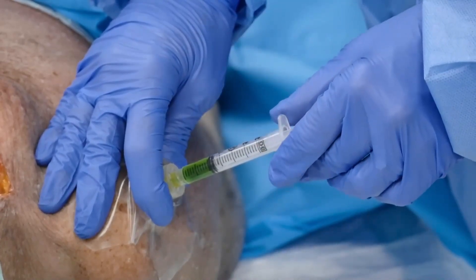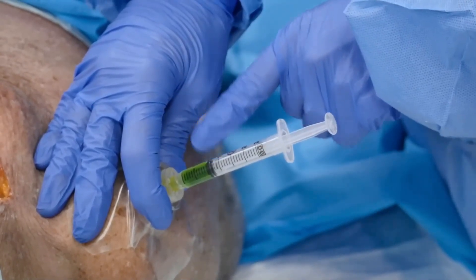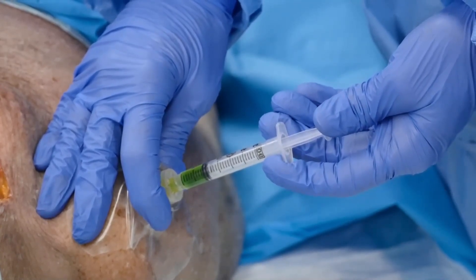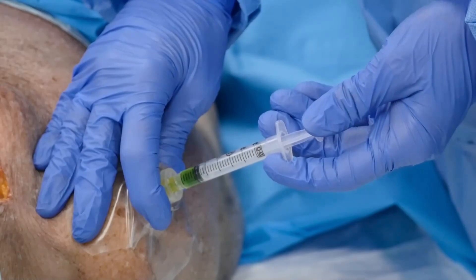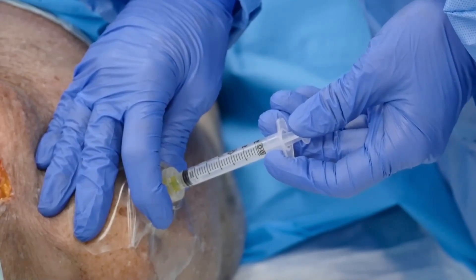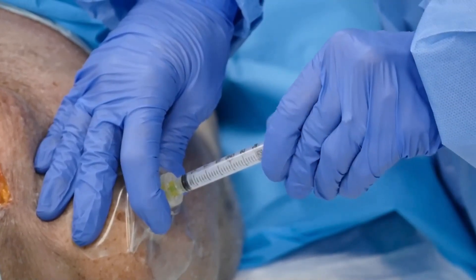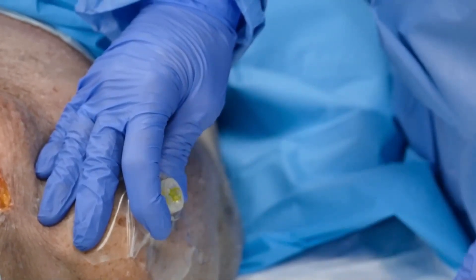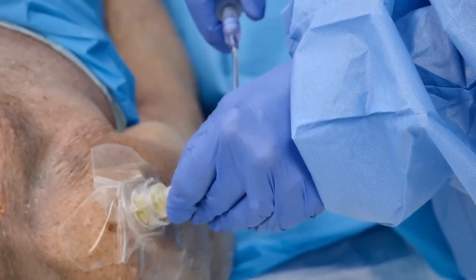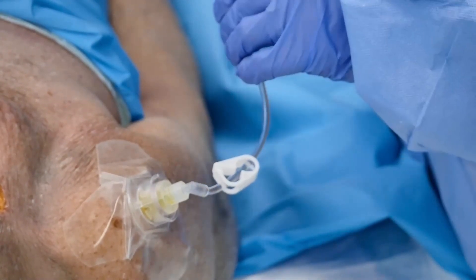I've reattached my medication syringe and I have my second dose of 20 milligrams of lidocaine — that's one mL of two percent preservative-free and epinephrine-free lidocaine. I'm going to infuse that slowly over one minute, which is really going to allow the nerve endings that were covered in marrow during the first round of lidocaine to now have access to the lidocaine and numb up those nerve endings. When I attach my easy connect primed with approximately one mL of saline, I can infuse my medications and fluids as ordered.